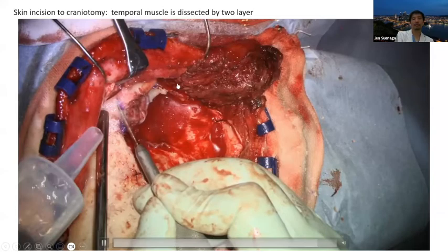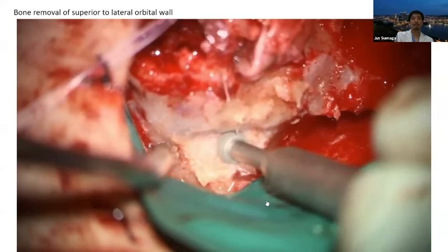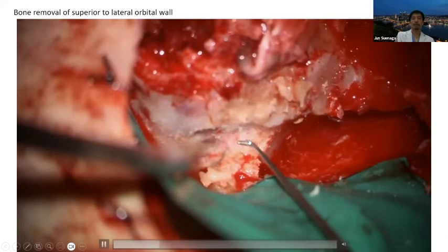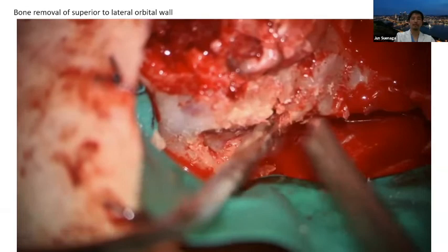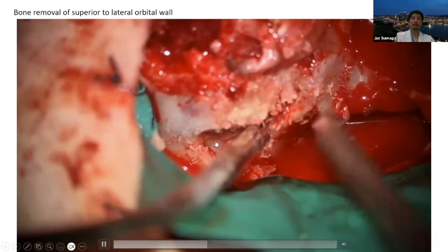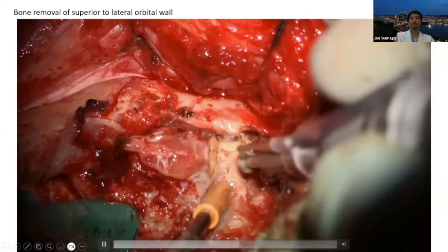Then we move on to the microscope — or recently the exoscope. The first important thing is to start with drilling of the orbital roof near the superior orbital fissure. This area is very safe because the periorbita and bone are not attached here. The lateral part of the periorbita is strongly adhered to the bone, so sometimes that part comes away. Nowadays I use the exoscope, so the lower angle is easily achieved.